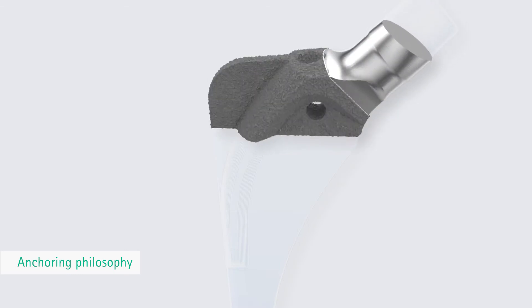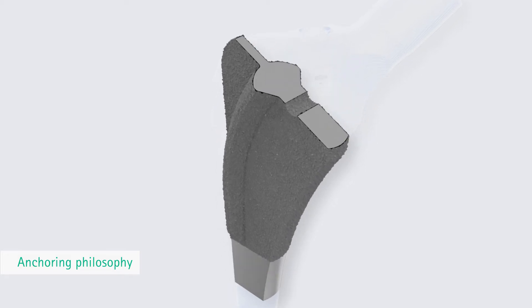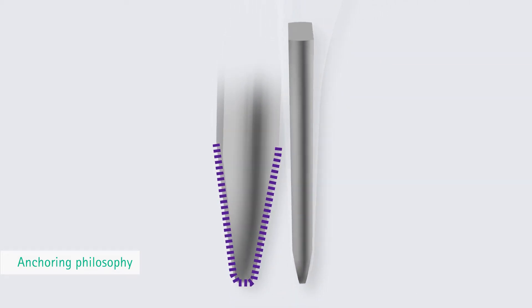The design solutions differ mainly in the upper medial section, which is responsible for anchoring the prosthesis. For all stem types, the distal stem is tapered into a flat, tapered end.